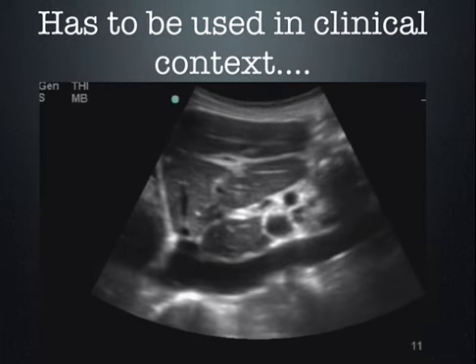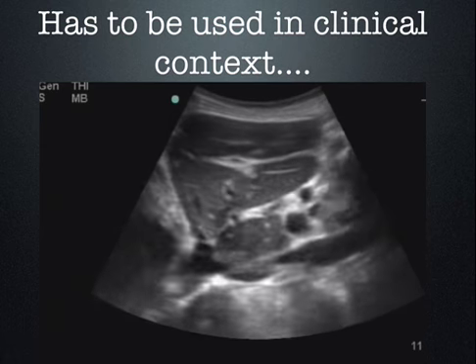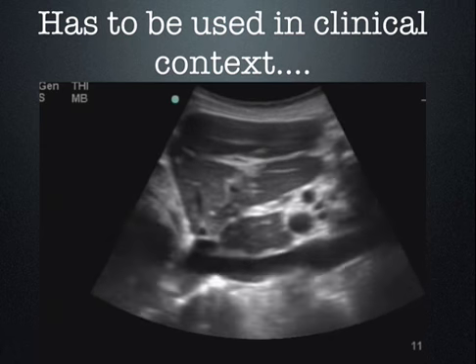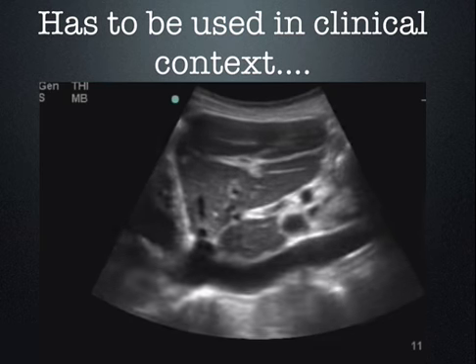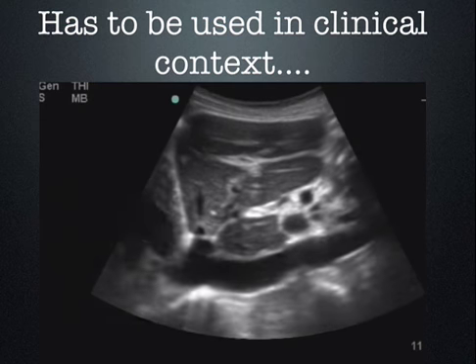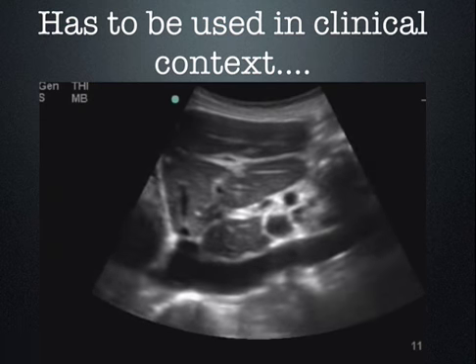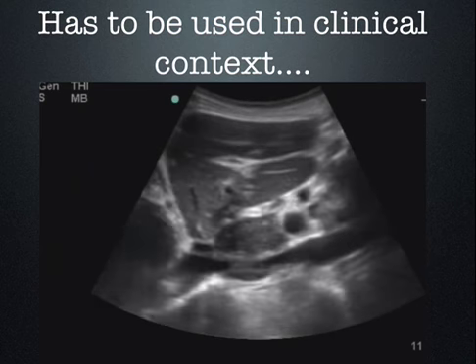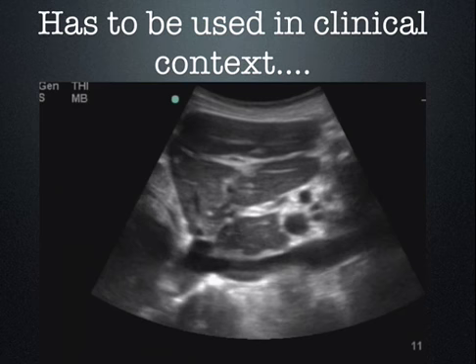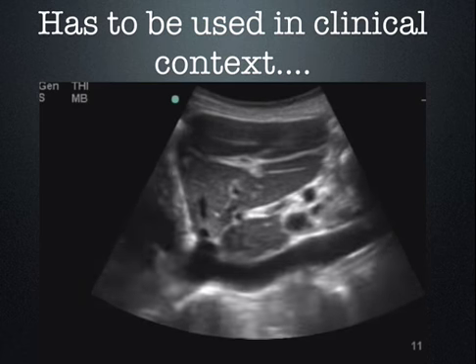So, it has to be used within the clinical context. We were scanning yesterday, saw a highly compliant IVC, very thin. This is a person who is clearly not in shock and has, frankly, no complaints. So you're going to see highly compliant IVCs. If that patient is well and they have normal blood pressure, they're not clearly in shock, you do not have to give them a fluid bolus. All right? So always remember that. Again, I will say clinical context reigns supreme.